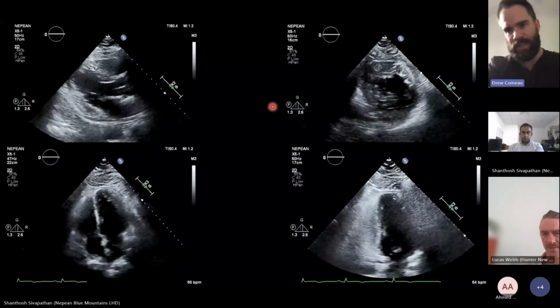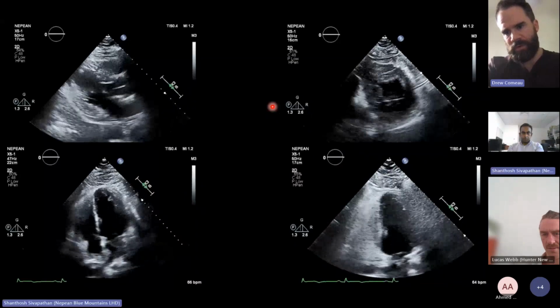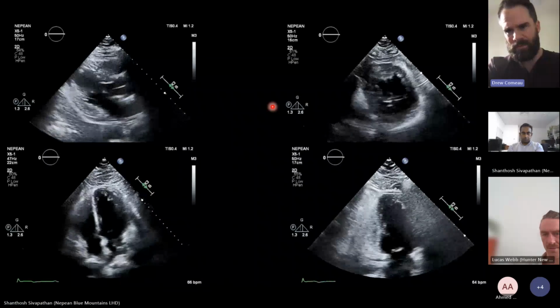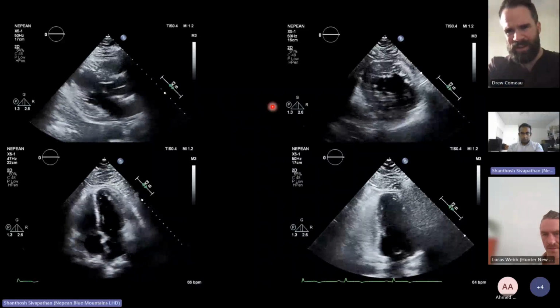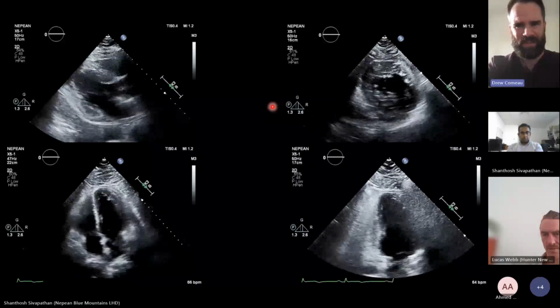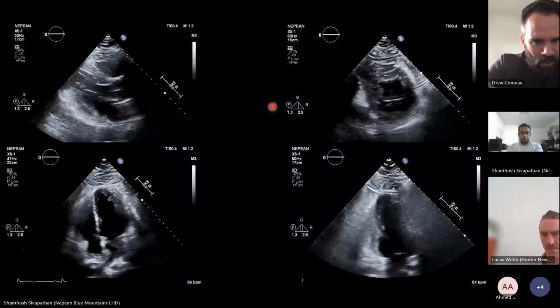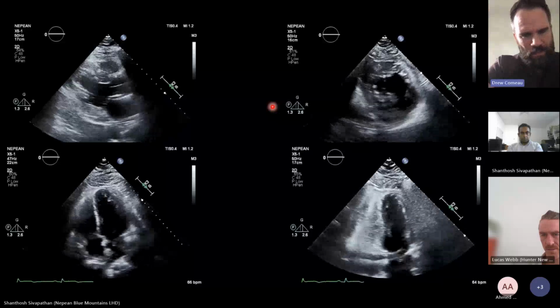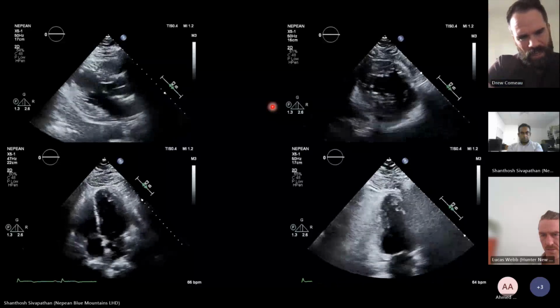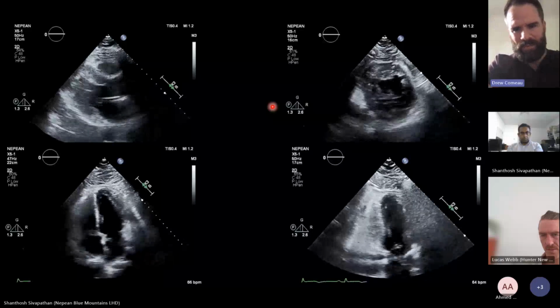Gosh, so it looks like the inferior septal, inferior and inferior lateral at the mid area is hypokinetic, within the limits of this. Within the inferior lateral region, I think there are some hypokinetic regions in the mid-inferior septal and probably the apical septal region.